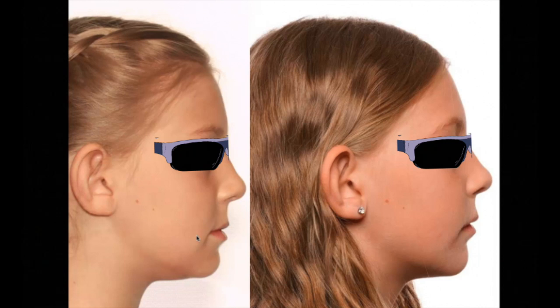Now, is that the vertical increase? I want you to think about this. Is that the vertical increase that we're probably going to see long term? Or another way to ask that, what accounts for that vertical increase? Assuming that her teeth are touching in both of these photos and there's not an expander in both of these photos, both of those things are true. So what accounts for the change in the vertical specifically?